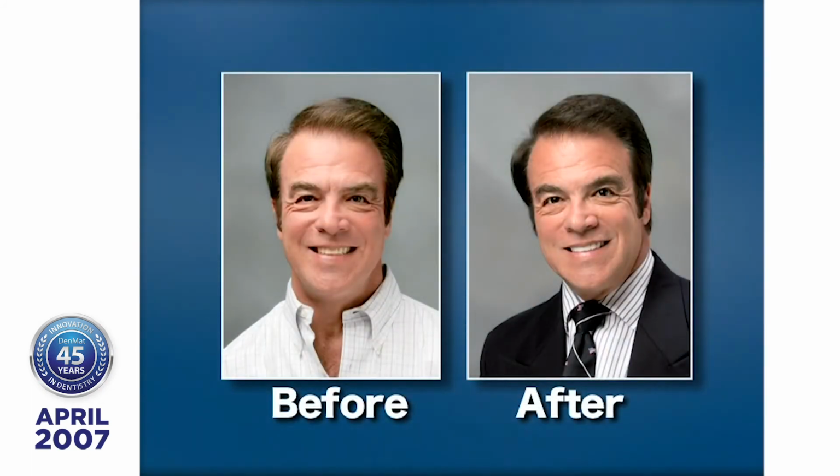That's good. And so we're about 90% finished. We've opened the contacts. We've established occlusion. We've bonded 8 porcelain veneers on somebody who didn't need anything but wanted something. So this is where you get to significantly expand the treatment modalities in your practice.